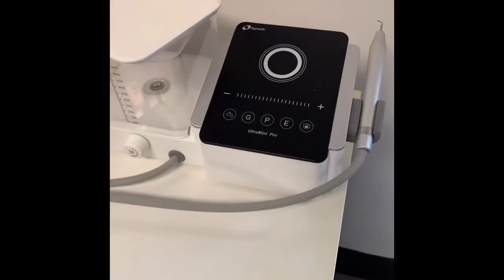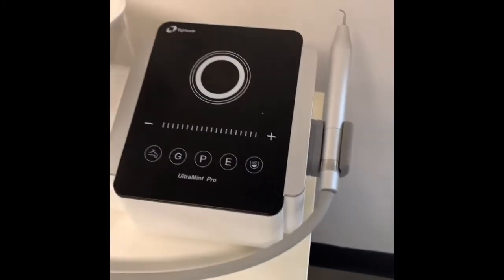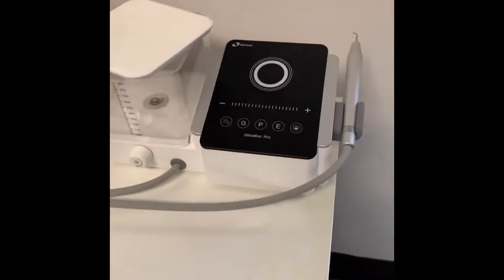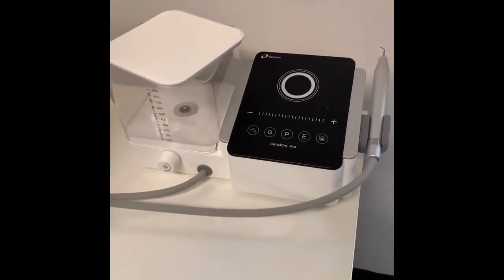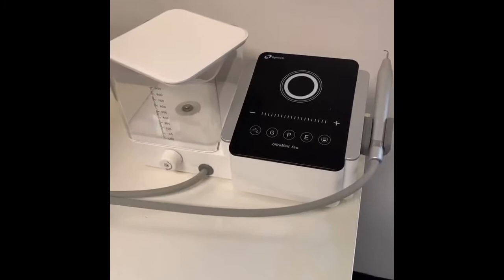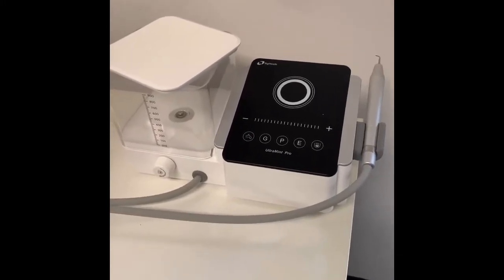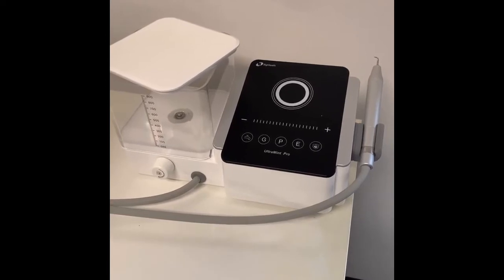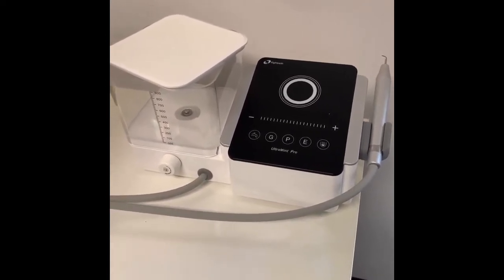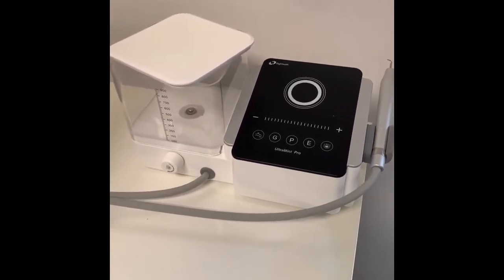Good morning, everyone. You guys know how much I love this Ultramint Pro from Eighteeth. This device is absolutely amazing. I have so many endodontic ultrasonic units, and they just break down on me. They seem to be low quality, even though I buy them here in the United States.